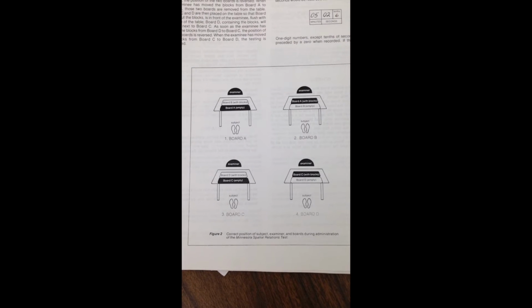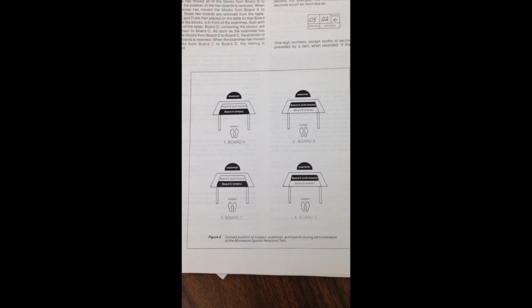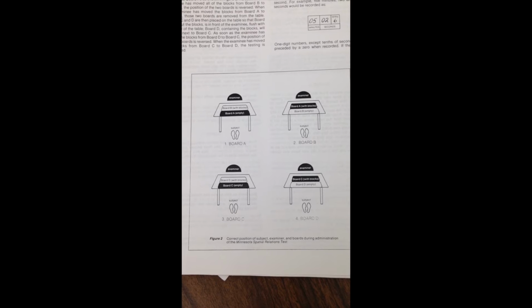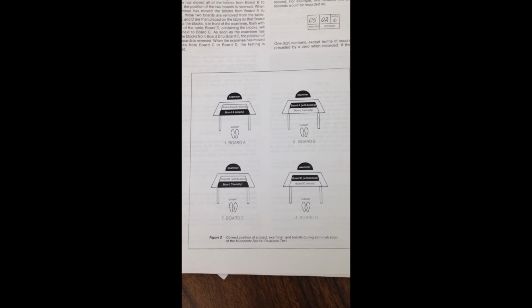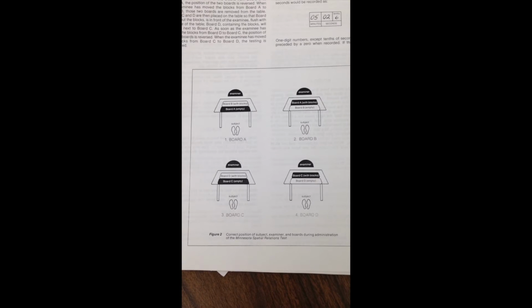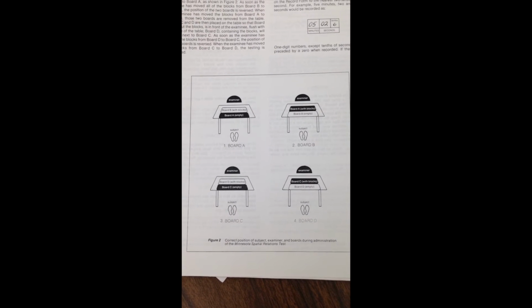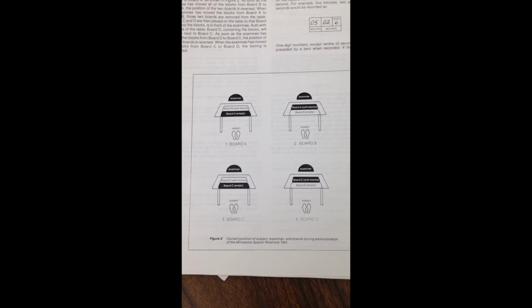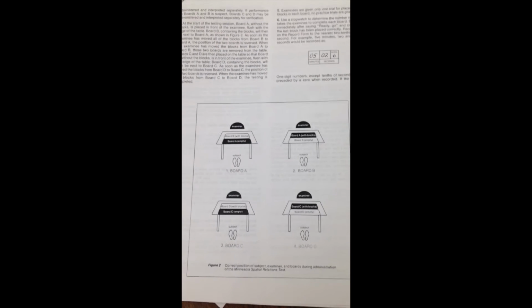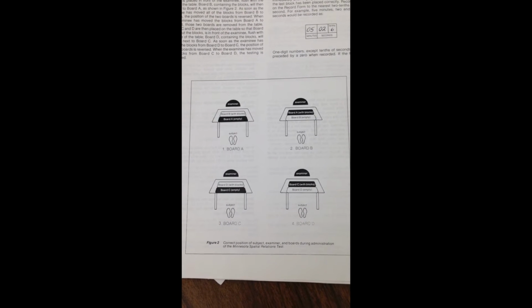When the examinee has moved the blocks from board A to board B, those two boards are removed from the table. Boards C and D are then placed on the table so that board C without the blocks is in front of the examinee, flush with the edge of the table. Board D, containing the blocks, will then be next to board C. As soon as the examinee has moved the blocks from board D to board C, the position of the two boards is reversed. When the examinee has moved the blocks from board C to board D, the testing is complete.